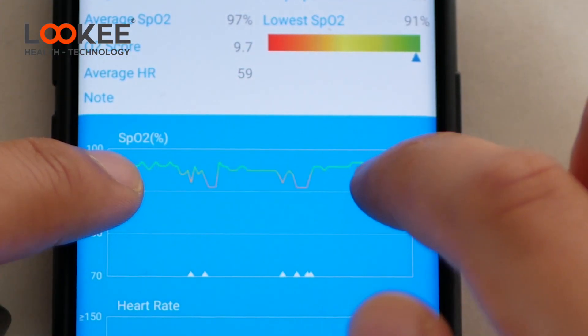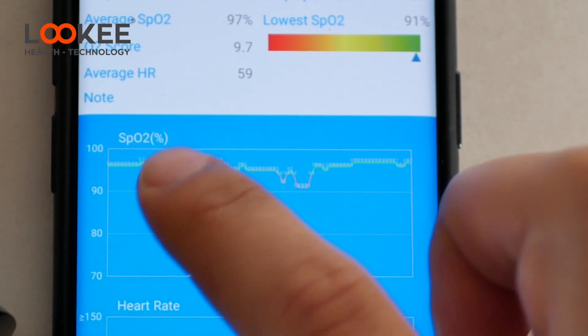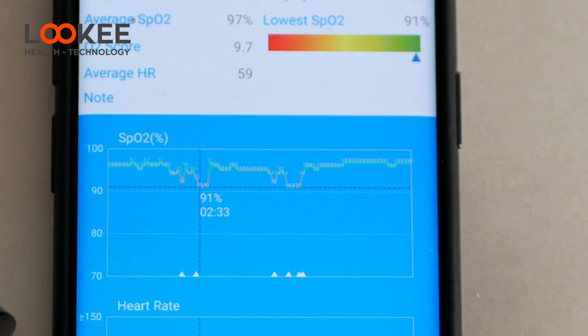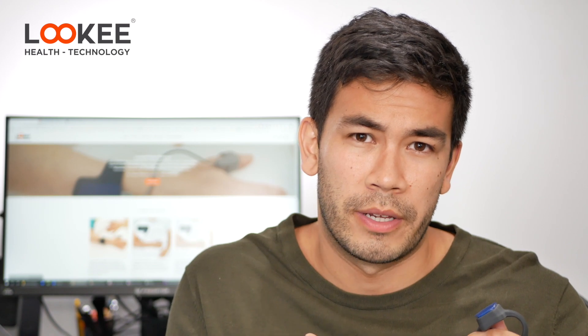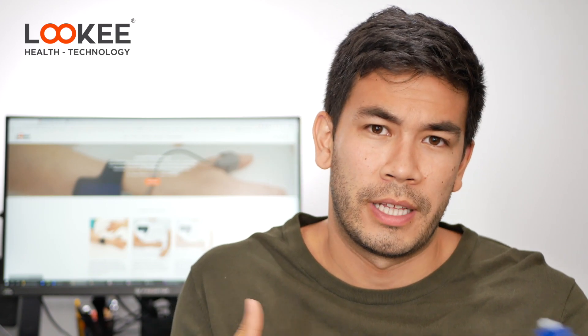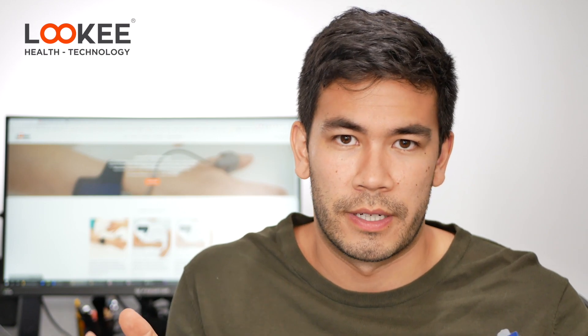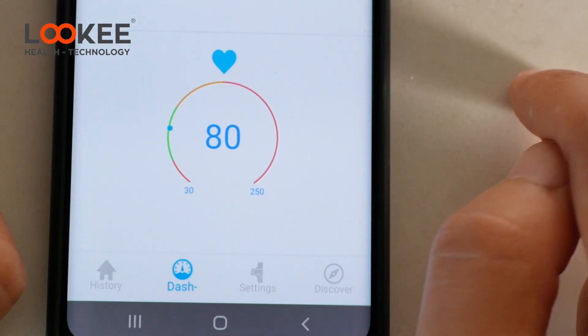You can zoom in to see more details, which is a very nice feature because a lot of sleep tracker apps only show a simple graph — you can't zoom in or see what specific minute or second you had a significant drop in blood oxygen saturation. I really like how there's a lot of detailed information in the app and it's simple to use. You can also get real-time heart rate and SpO2 readings from the second tab.